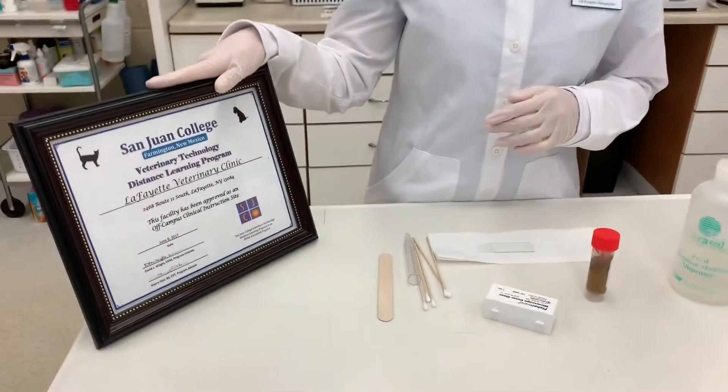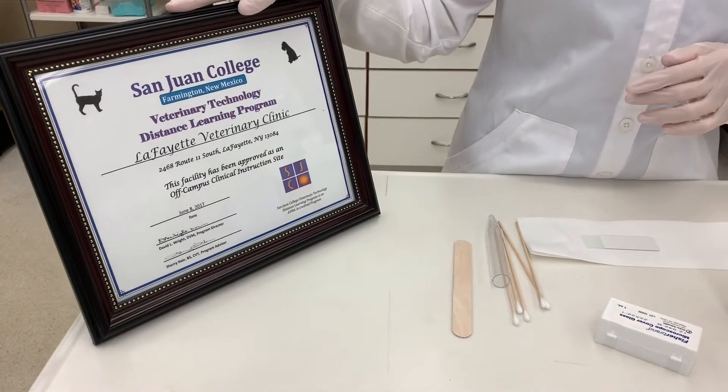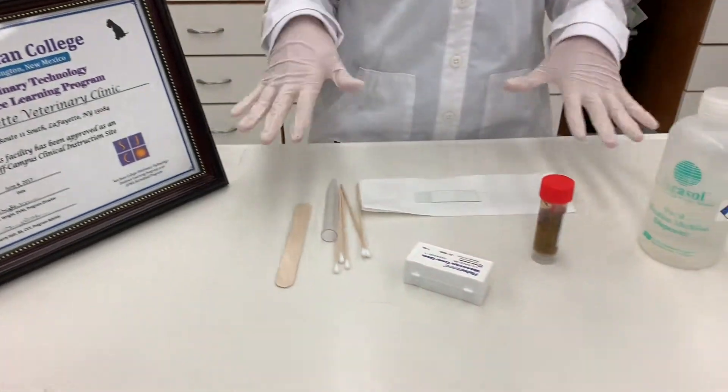Hi, this is Jessica Fox filming for VETT 222 Task 15, which is the fecal centrifugation with flotation. I will show you the OCCI certificate here at the Lafayette Veterinary Clinic and then the supplies needed.